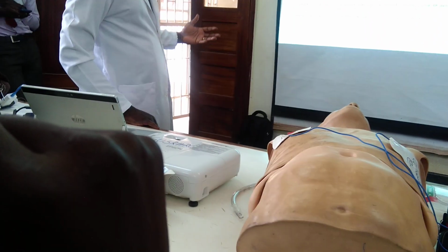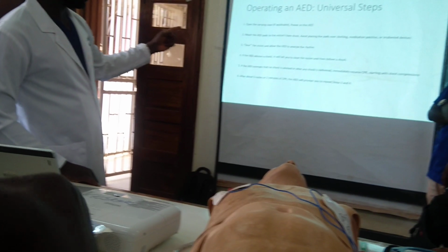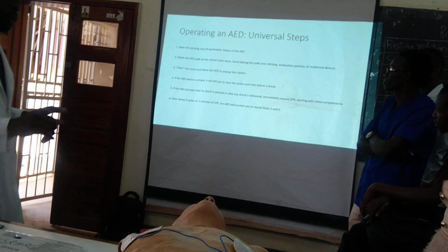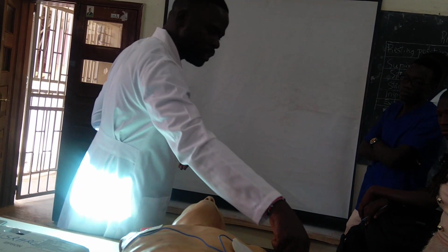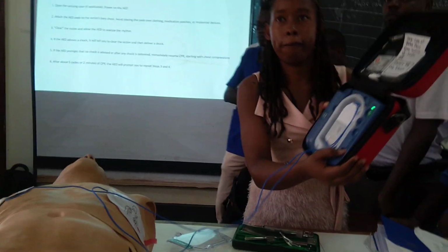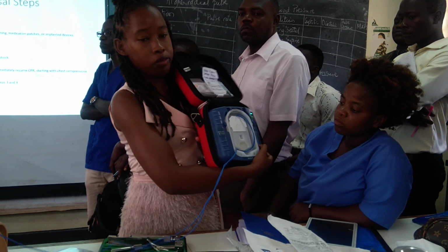If the AED advises a shock, it will tell you to clear the victim and then give a shock. And that shock you're going to deliver by pressing this button. Because you're going to press that, now first ignore the voice. Ignore the voice.